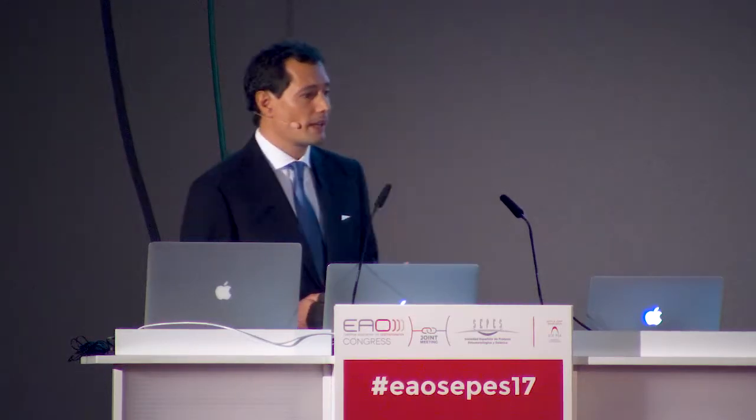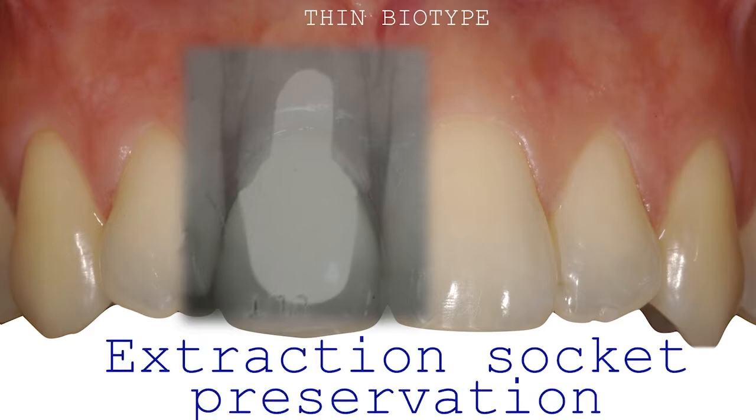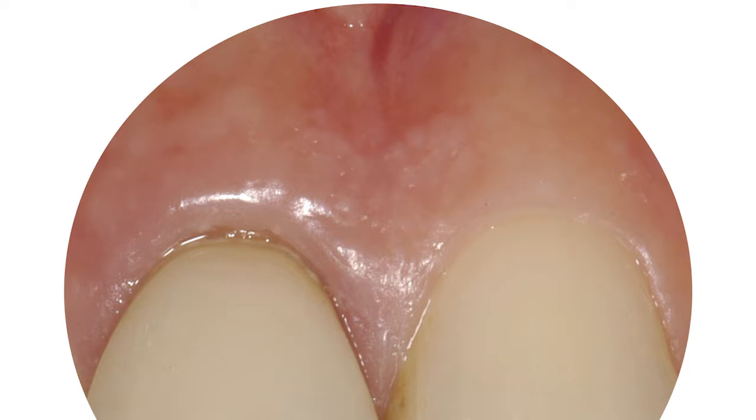So let's start looking at some cases where we can really understand how we can use Osstell. That's a failure of the central incisor due to endodontic failure, of course, but we're dealing with a very thin biotype. Biotype is really one of the most important surgical variables that needs to be evaluated prior to implant placement. So here, there is a overhanging restoration also. There is a swollen free gingival margin.